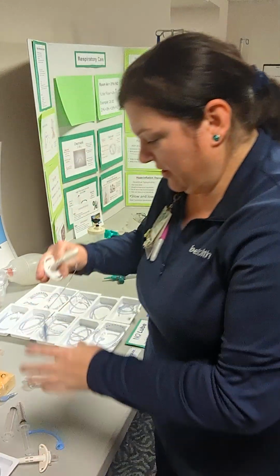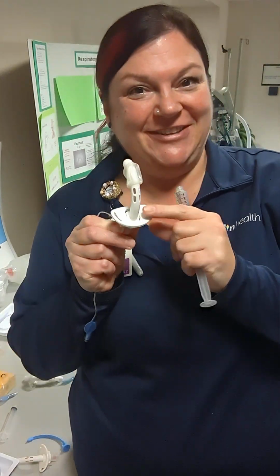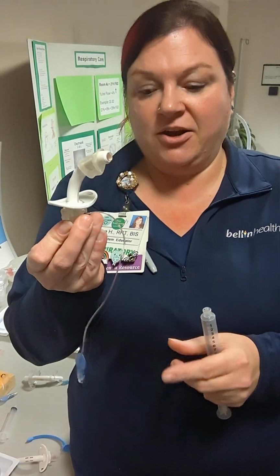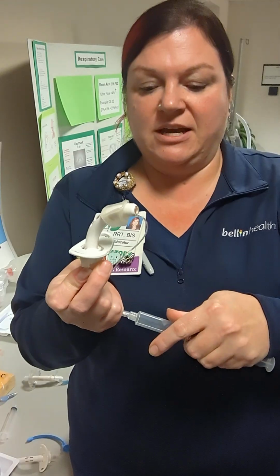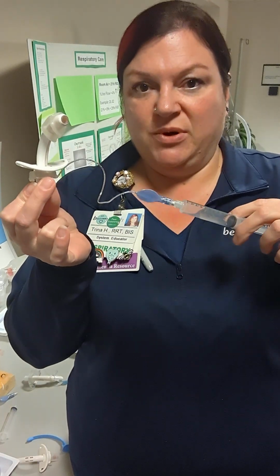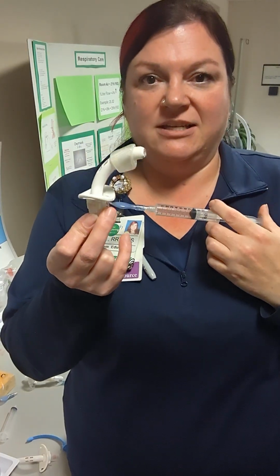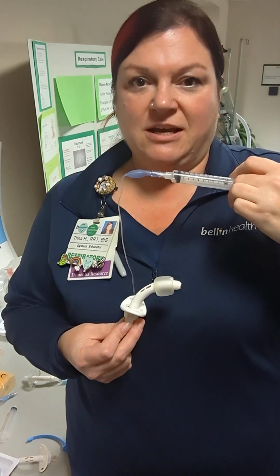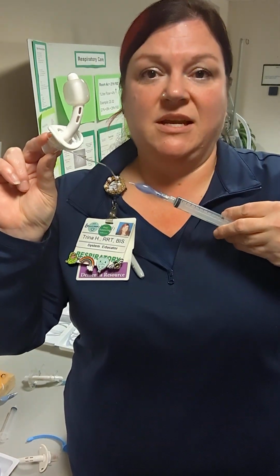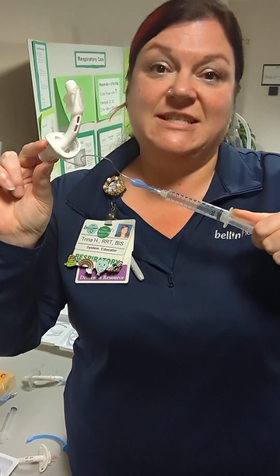This type of trach is called, first we have fenestrations, right? But this trach is cuffed, all right? And a cuffed trach means that there is a balloon at the end. So I'm going to put air into this little pilot balloon, and it's going to inflate. So now this is cuff up, meaning inflated. This is cuff down, so it's deflated.